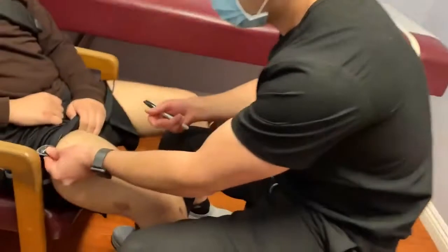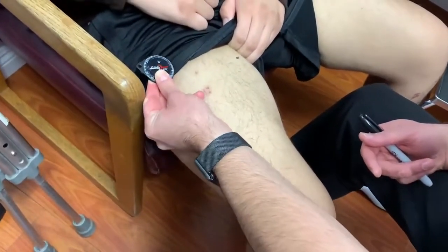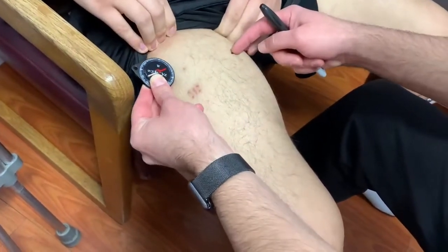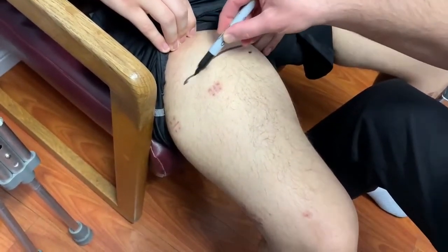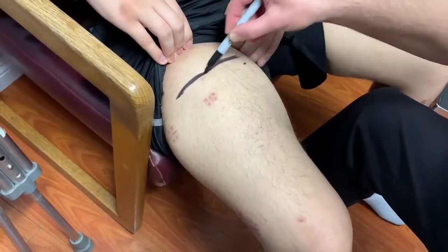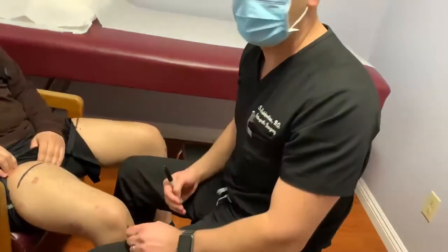We do this and the compass points to where the magnet is exactly. This is his original location, so he's already moved down a little bit. We're going to mark it a little bit higher than where it was before. Now the machine has to follow that line to make sure that the nail continues to communicate with the ERC.